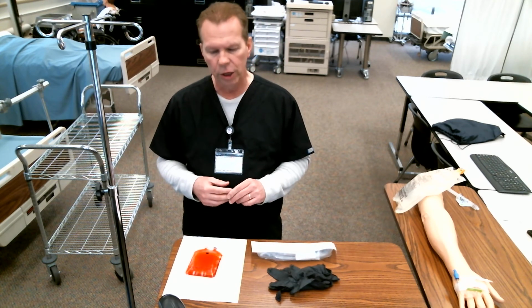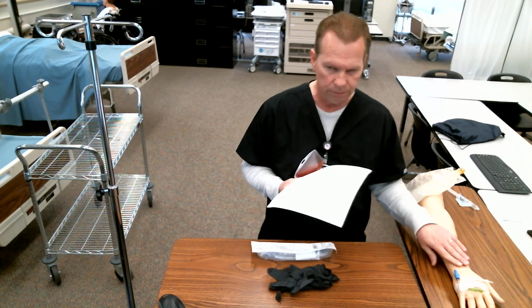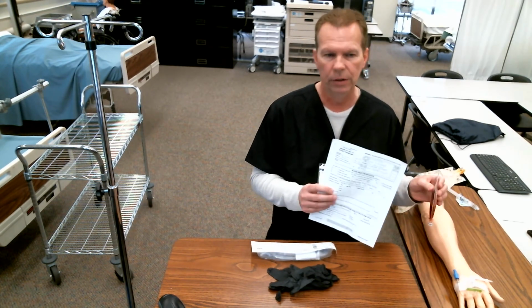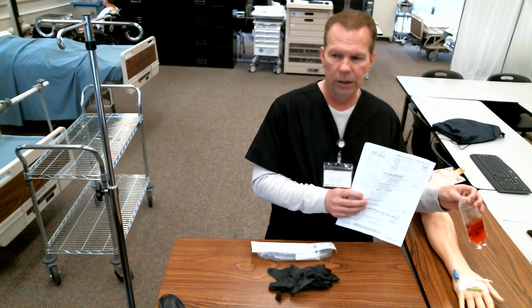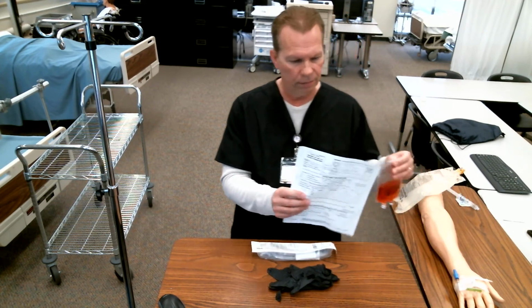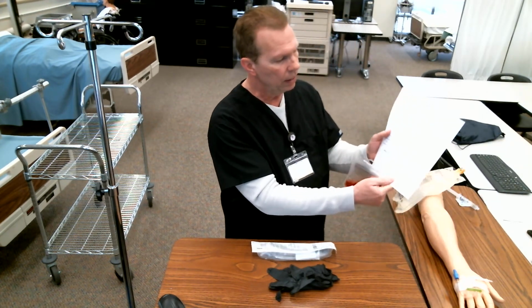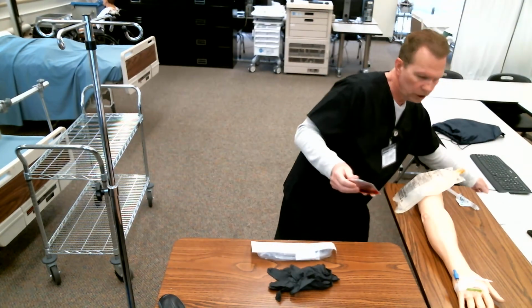All right, for our third check, then our third safety check, we're going to take our paperwork, we're going to take our blood, and we're going to go into the patient, and we're going to verify everything by the patient's blood bands and hospital ID bands that are on the patient and ask them their name, verify by 2 means, and we're going to make sure that the numbers on their bands match what's on the blood and matches the paperwork. So that is our third and final check there. So once we've done all those safety checks, and you have another licensed personnel with you in that room verifying all this, so it's 2 people there. Then once you get done, you're going to sign that off. And so now we've got our safety checks done.